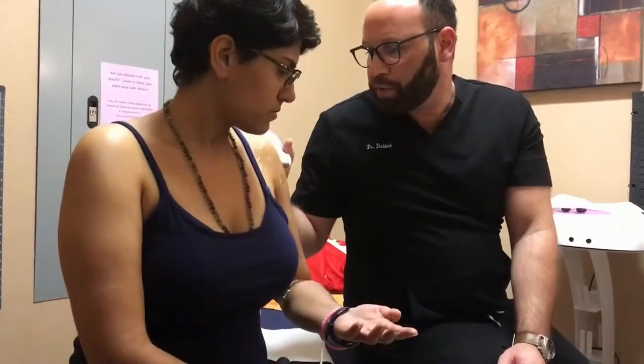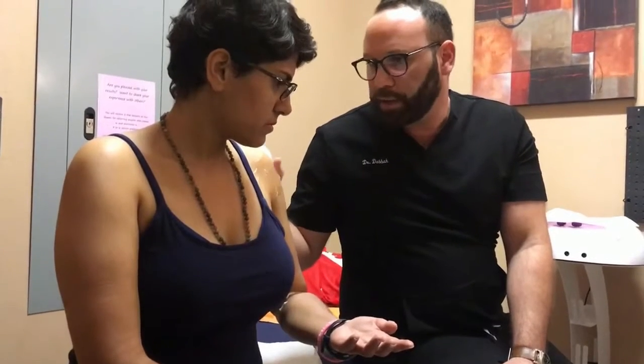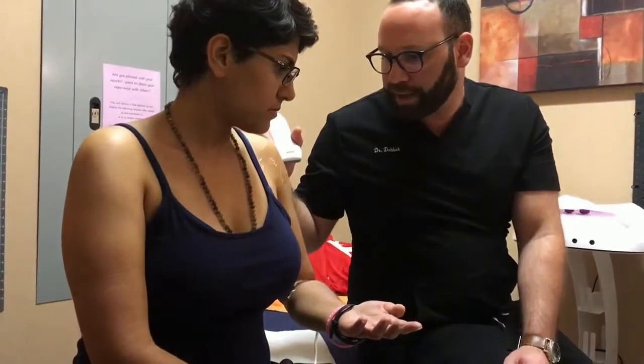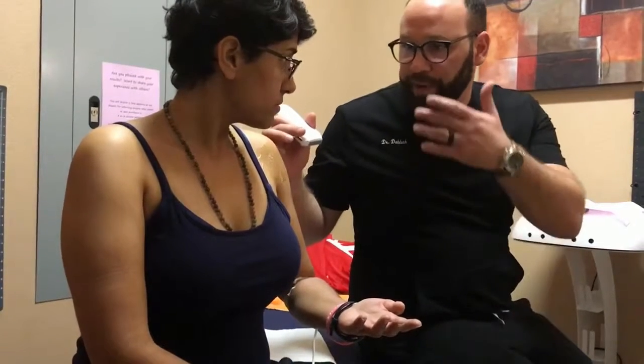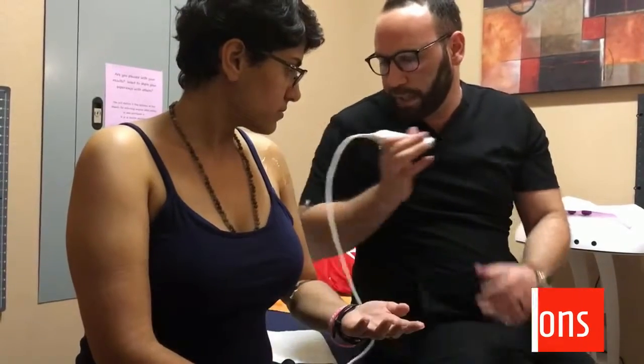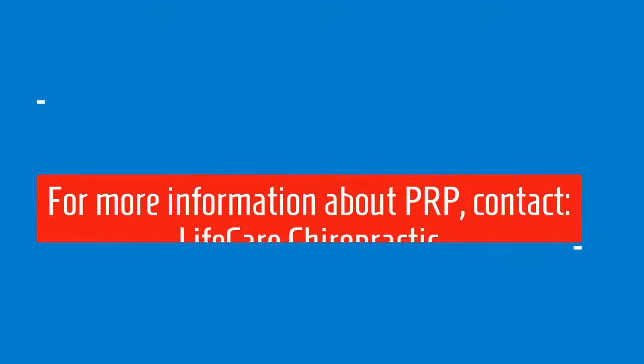I remember when you were doing the exam you had some pain along this area right here. So what I'm going to do is put half of the PRP into the joint, and then pepper the other half along that joint line.